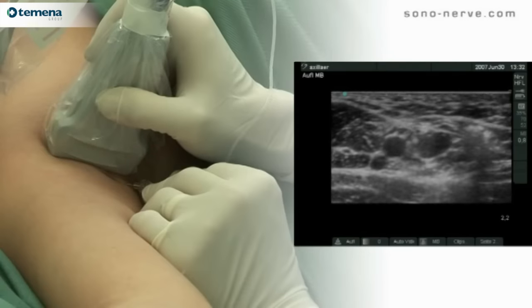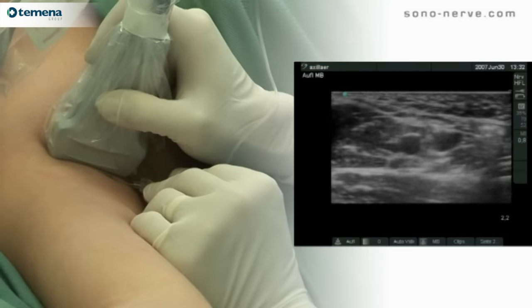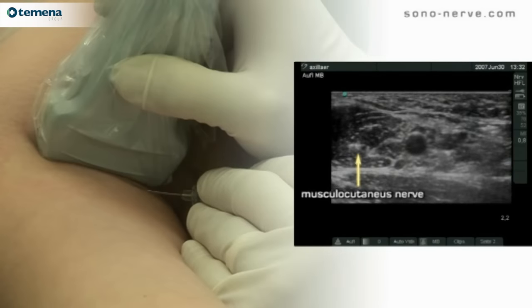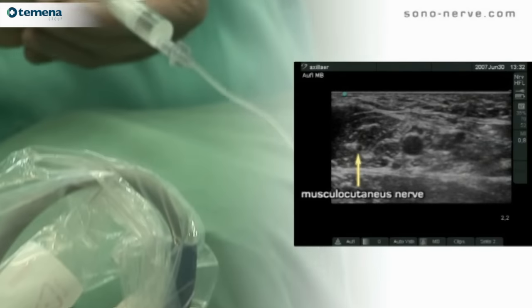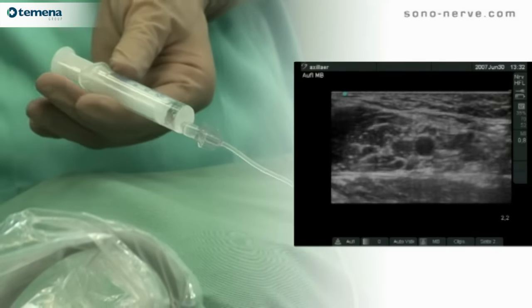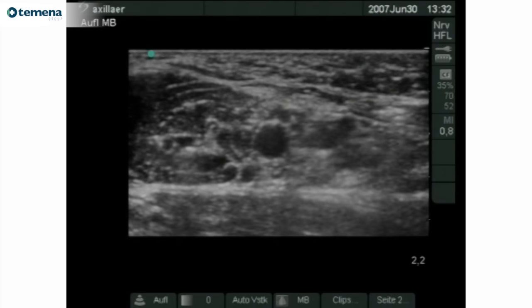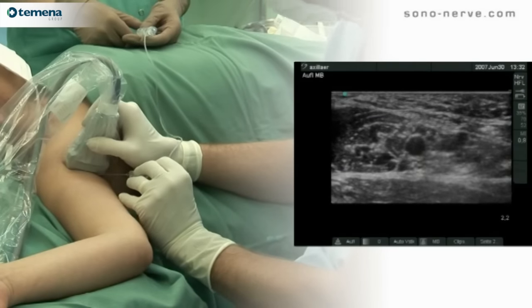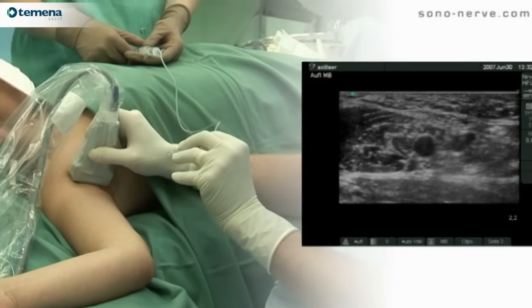In addition to the ulnar, radial, and median nerves, the musculocutaneous nerve should now be blocked. The needle is passed through the body of coracobrachialis towards the clearly visible musculocutaneous nerve. Once the needle is placed in close proximity to the nerve, injection of a very small amount of local anaesthetic will surround it and effectively block it.